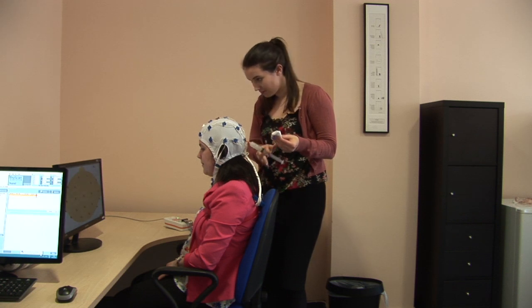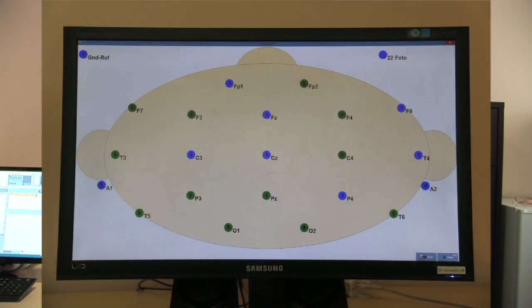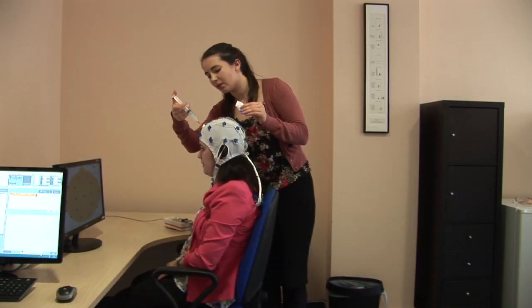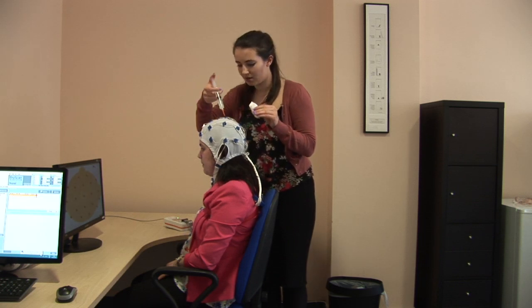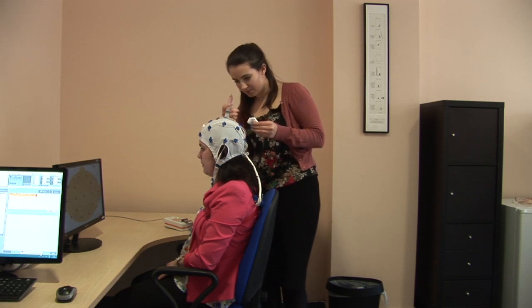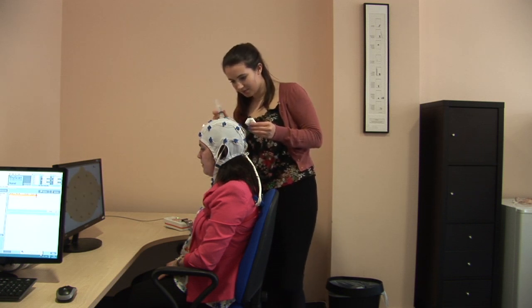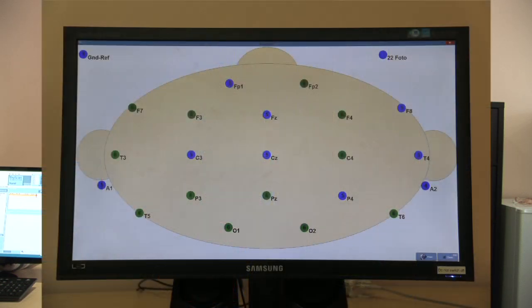As we put electrode gel into each of the electrodes, you'll notice on the screen that the little graphic begins to change colour. Now, this graphic tells us the signal quality, or as it's called, impedance. So as part of getting the EEG signal right, we want to make sure that we get a good signal at each one of the electrodes. So you'll notice as we put in gel, the electrode colour on the screen begins to change, and our goal is to get those values as low as possible.